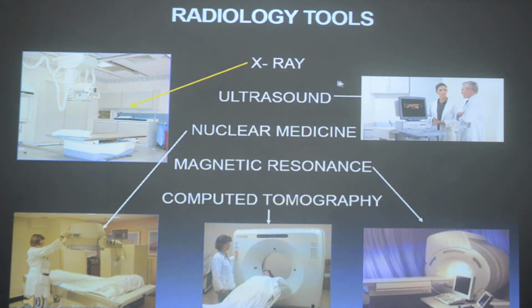Okay, so X-rays. Do you think there's a role of X-ray for the brain? Yes? I don't think so. Okay, he's right. There's no role of X-ray in the brain because the brain tissue is not seen on X-rays.